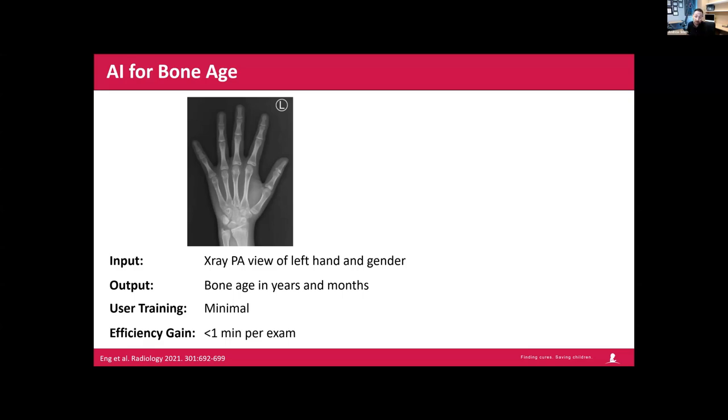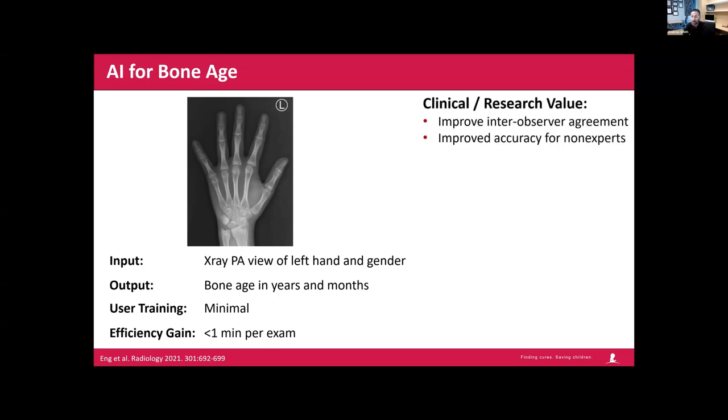I do not know what people sell this algorithm for, but typically algorithms are sold somewhere in this $25,000 to $50,000 per algorithm range. So you'd have to have quite a few days saved to really justify that. And that really doesn't justify all of it because you have legal looking at it, you have all the install costs, all the time of informatics reviewing this, information security reviewing this, et cetera, to justify the use of this algorithm.